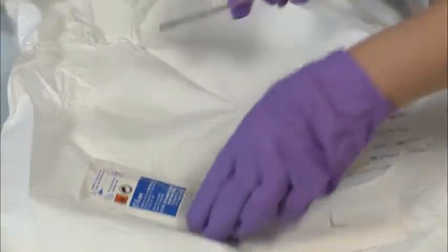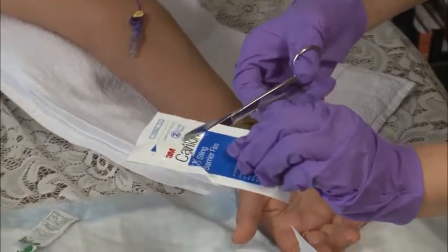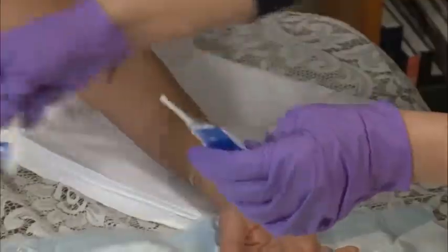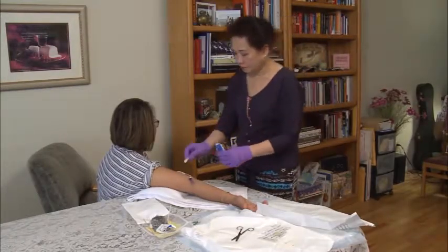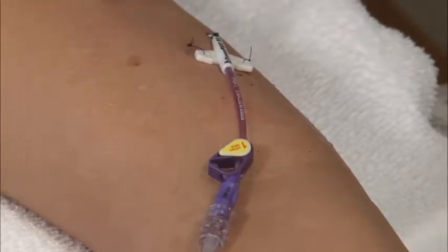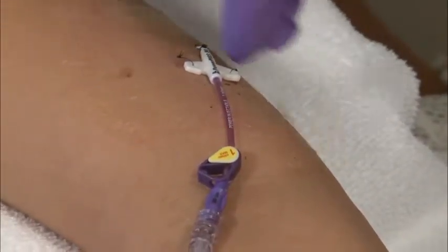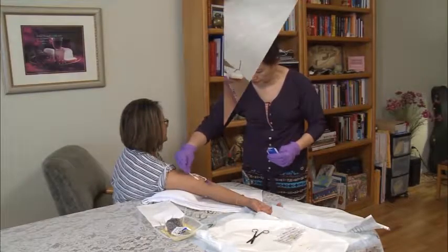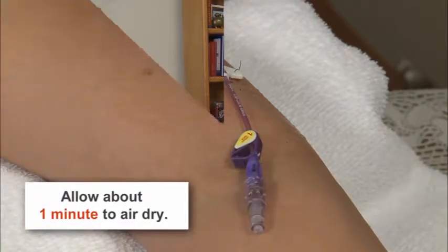Now open the protective skin barrier packet. This helps protect the skin from the adhesive. Cut the pack open with the scissors provided. Do not wipe the insertion site itself. Swab all edges of the cleaned area. Allow about 1 minute to dry.